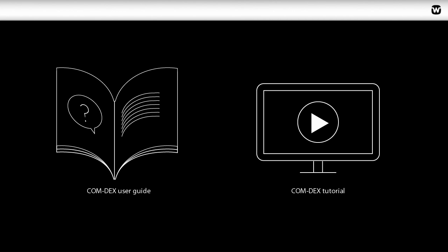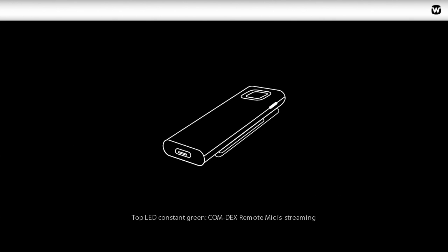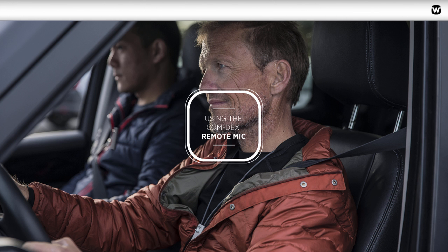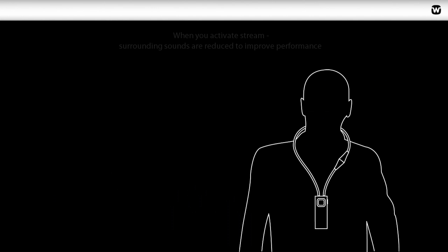When successfully paired and turned on, the Remote Mic will automatically start to stream sound and the top LED will turn constant green. Now that the Remote Mic is connected to your Comdex, it's ready to use.